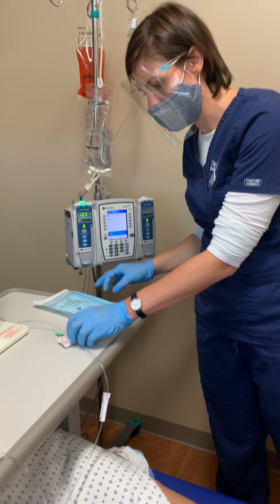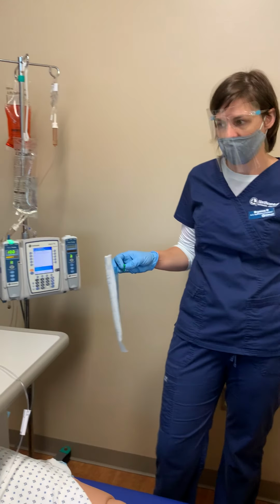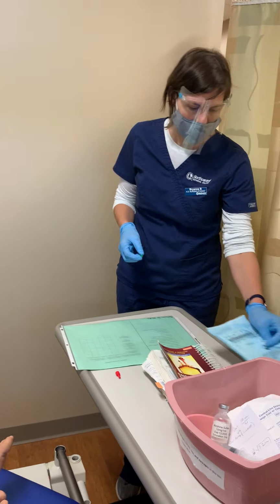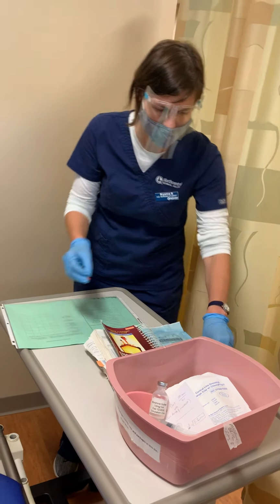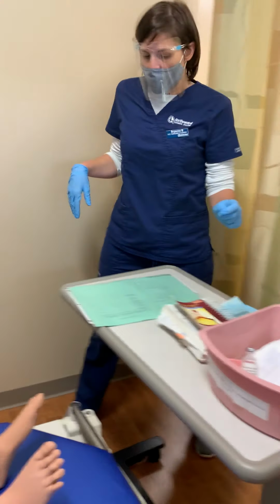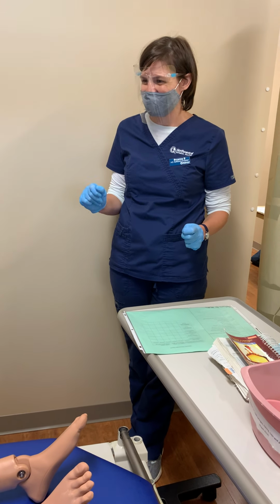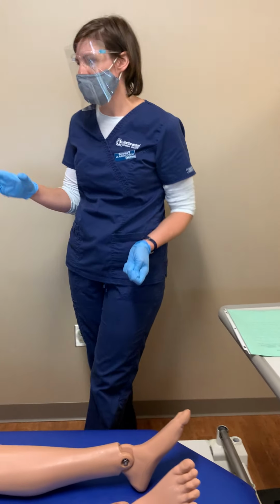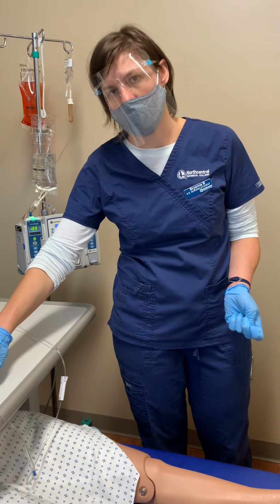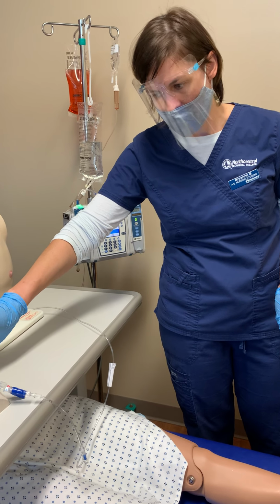So my potassium is now infusing as per doctor's order. I would clean up my stuff here and make sure that I'm not making a mess of the patient's room. All right. If I had to set this bag up, I would have also checked my site prior to starting any sort of fluids.